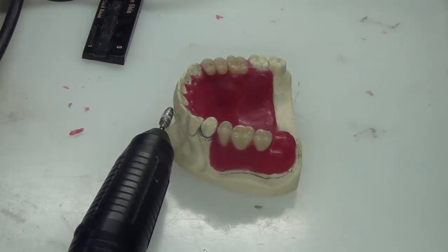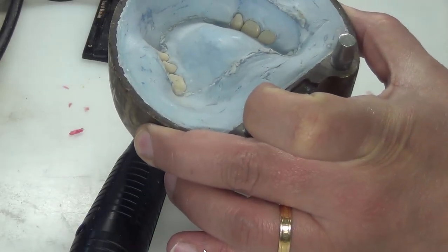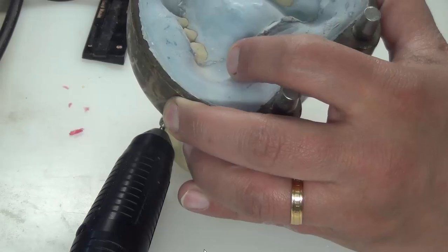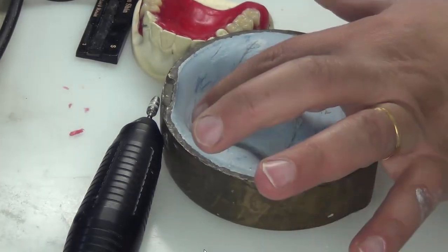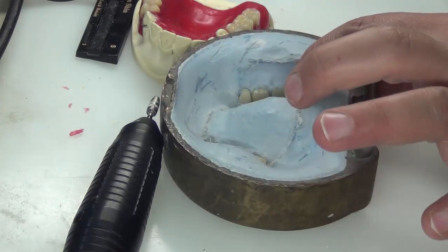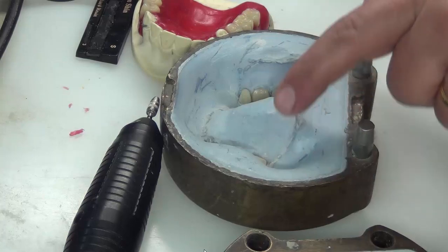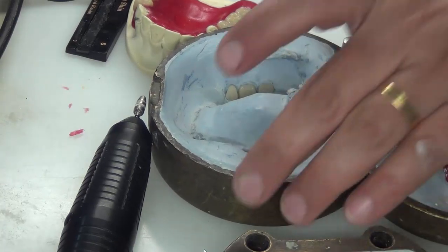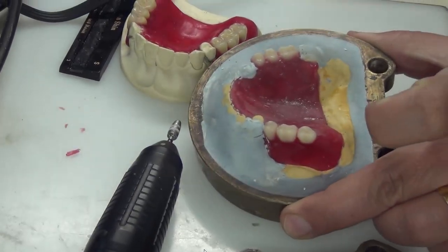where we need to separate the upper and lower flasks from each other during dewaxing. So we want all areas that were covered with teeth smooth on the upper member of the flask. Okay, so these are all smooth. How do we produce these? We had teeth there, okay? So how did we produce these? By cutting off the natural teeth that were there, okay?